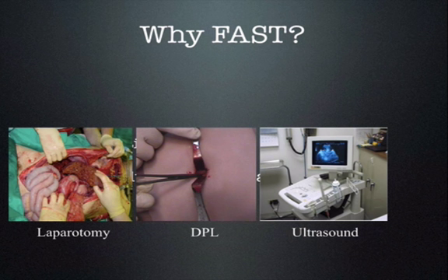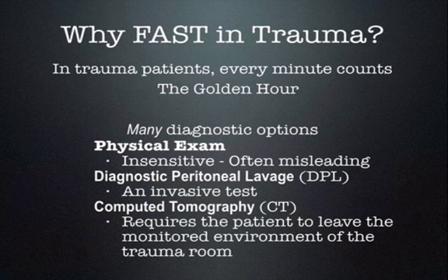So why do we want to use the FAST when we have many diagnostic modalities in the trauma patient? Well, in the trauma patient, every minute counts. This is why we call the first hour the golden hour. If we can make diagnoses quickly, we can have an impact on morbidity and mortality after trauma. There are many diagnostic options, however. Physical exam is the initial one we often choose. However, it is insensitive and often misleading.